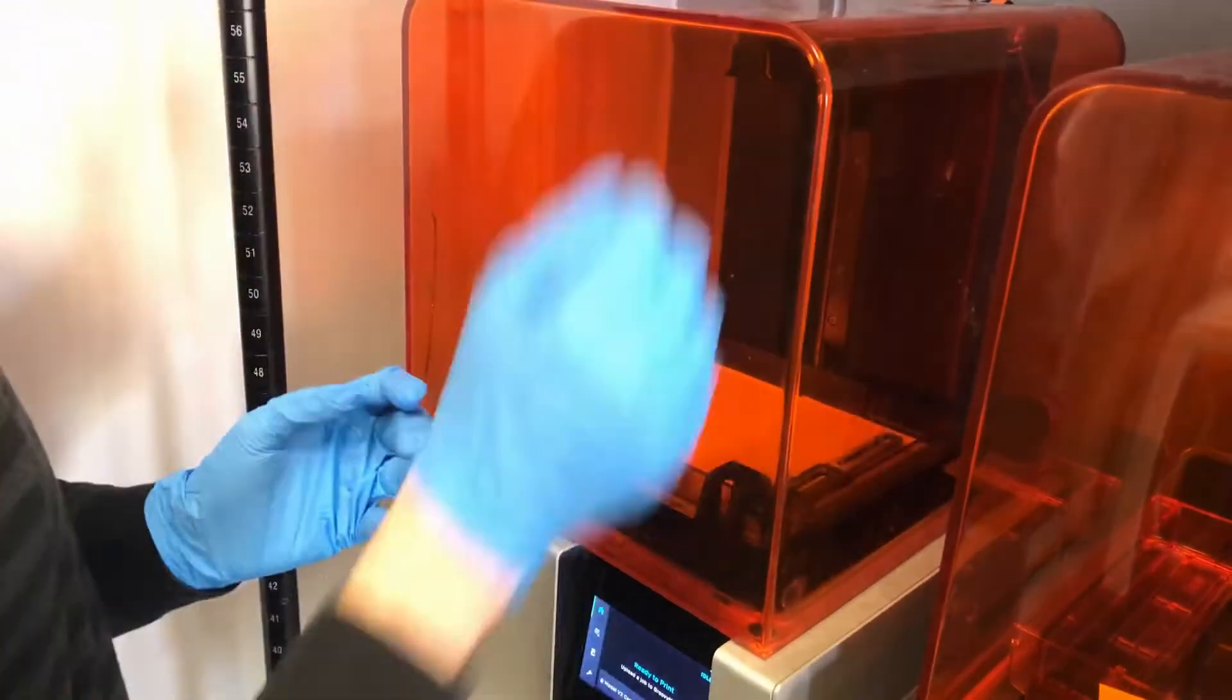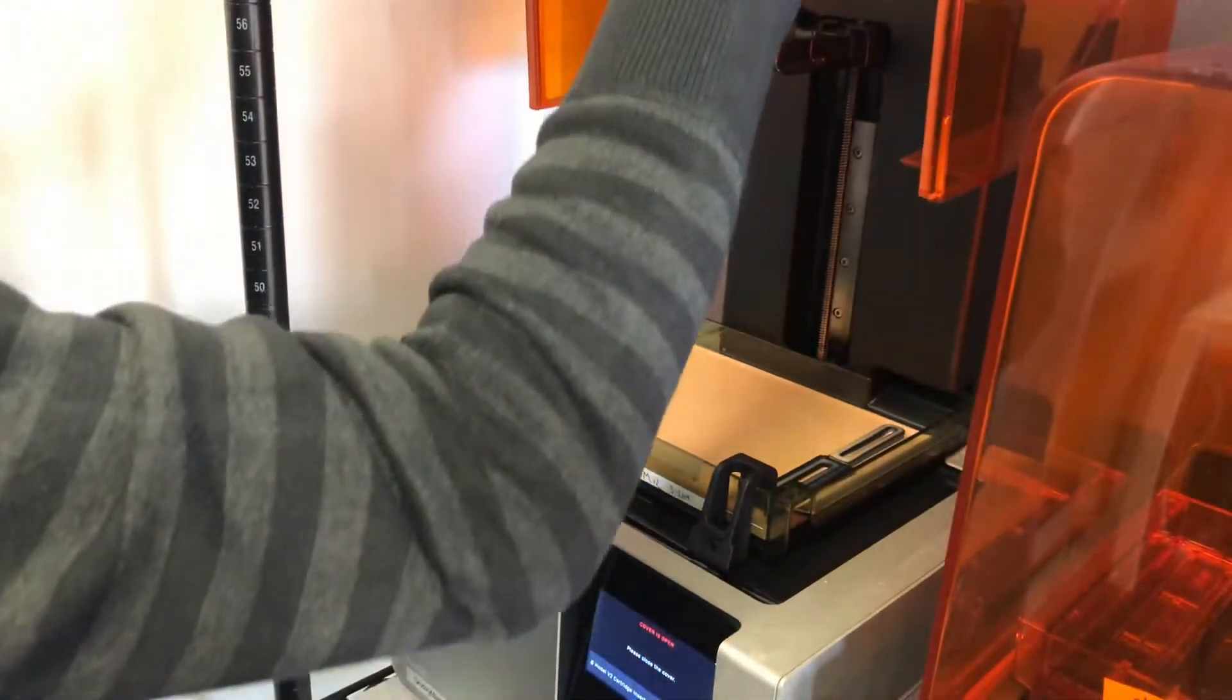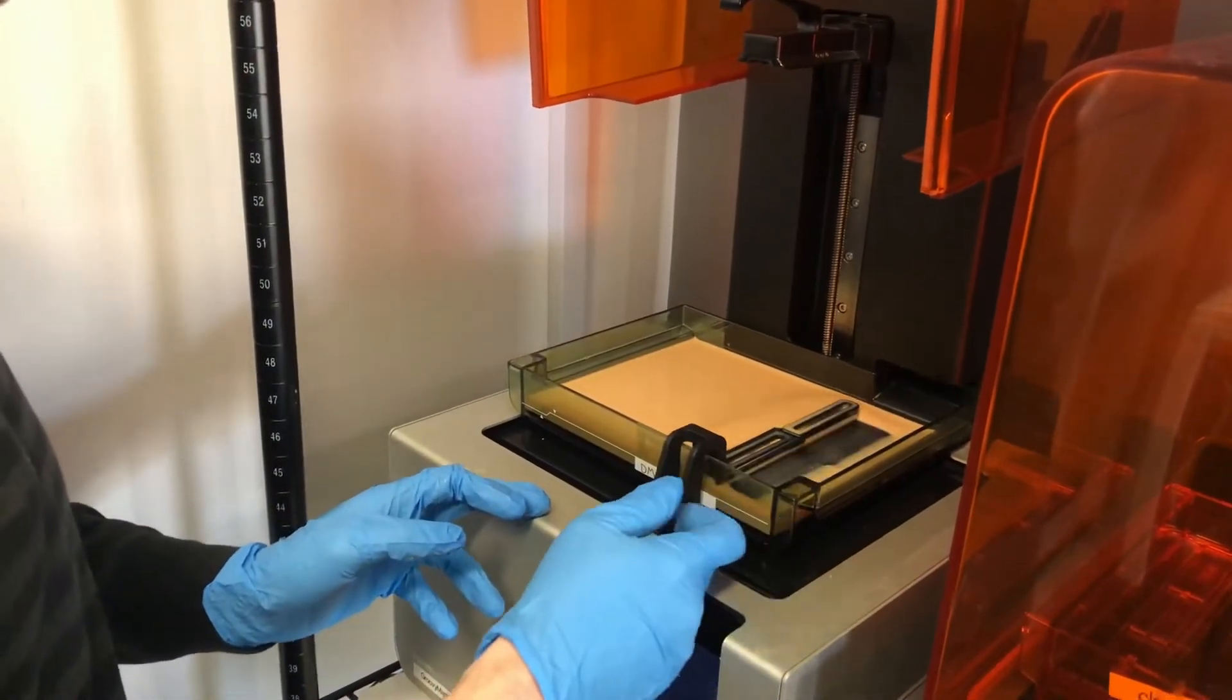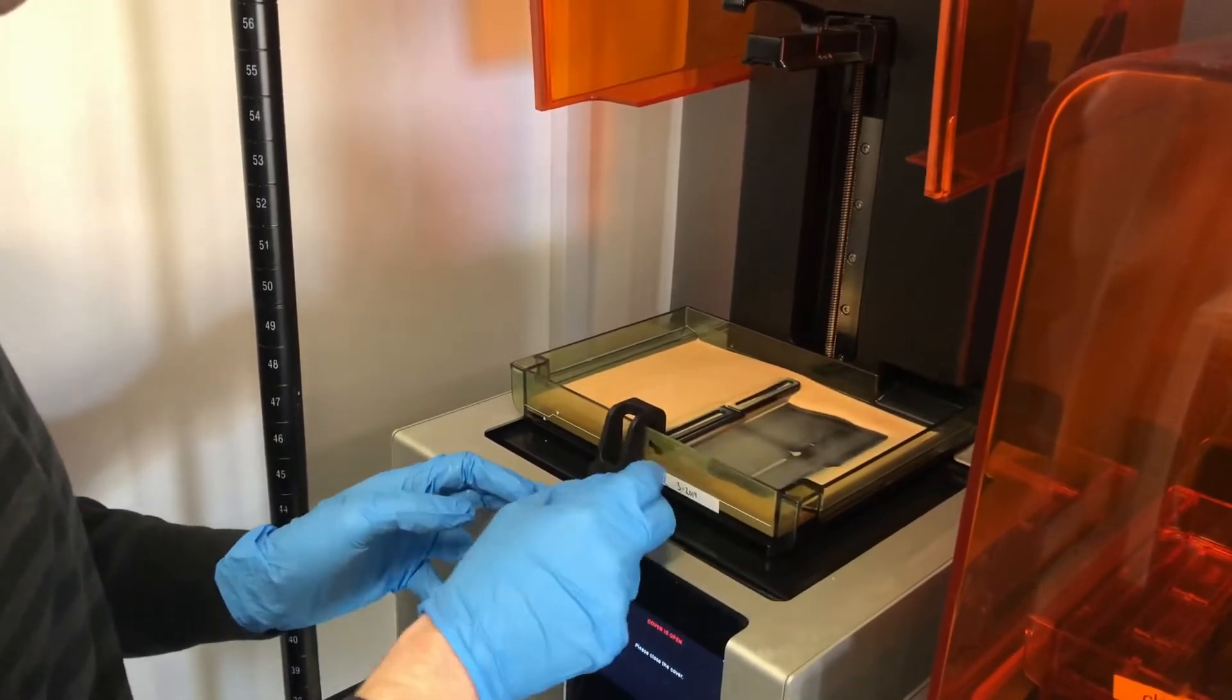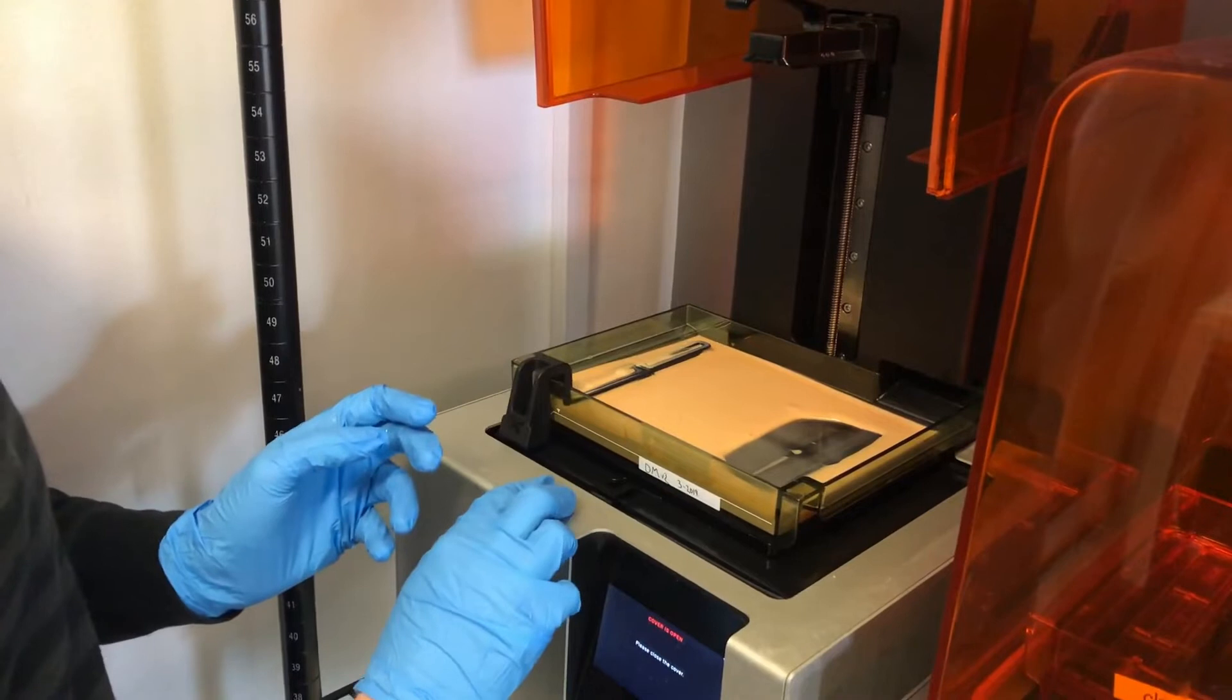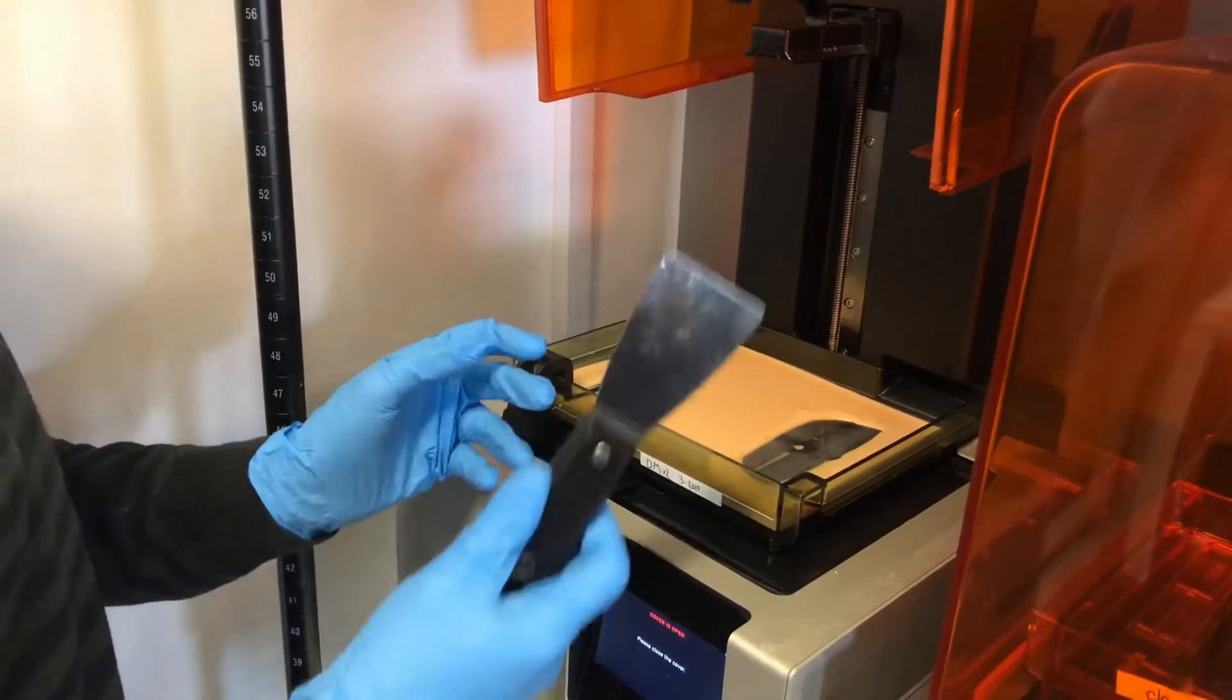Put it into place, pop that open. Now on the resin tank itself you can slide this pretty freely—it doesn't hurt the machine. So I'll slide this over, pop out the wiper here, and I'll take a scraper like this one.